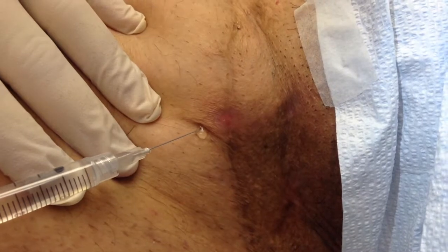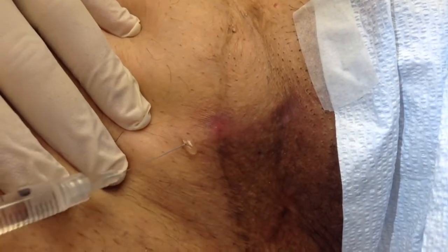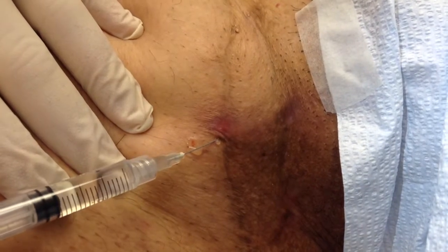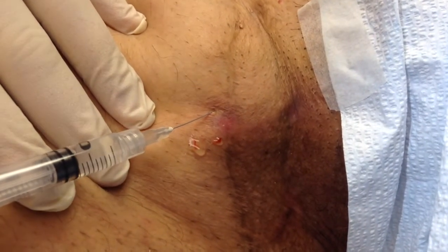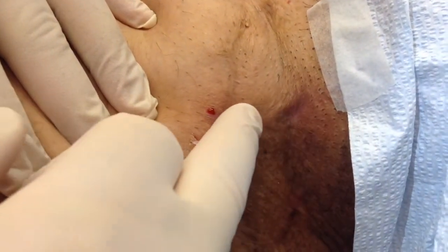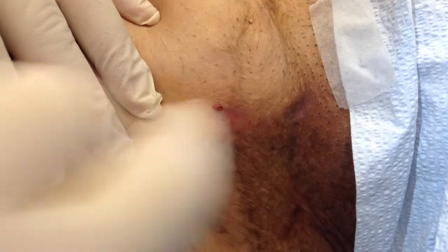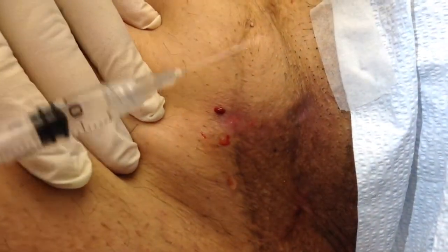So we're going to numb up. There's a little pinch. We're going to be doing cryo-insufflation. She's got one tunnel, and although it doesn't look apparent, if you run your finger right there, you can actually feel the tunnel there. So there's going to be one opening here, one here where we're numbing.